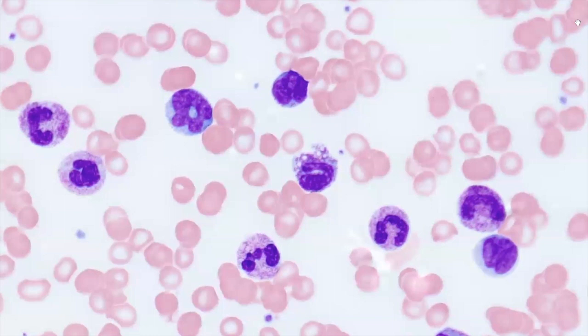However, it must be noted that degenerative changes resulting from storage of EDTA anticoagulated blood at room temperature also include vacuolation of neutrophils. It is not always possible to distinguish between toxic vacuolation and degenerative changes associated with the storage of blood.